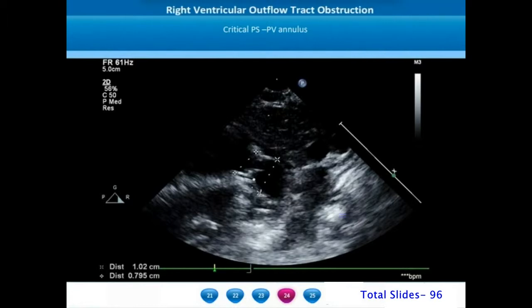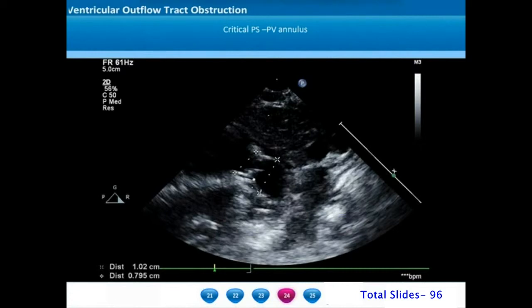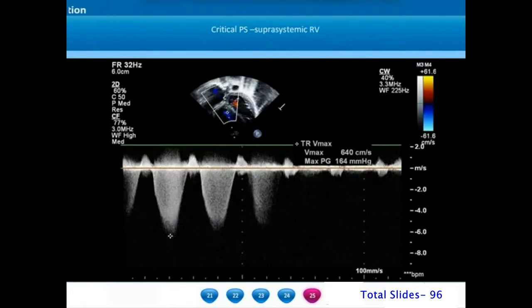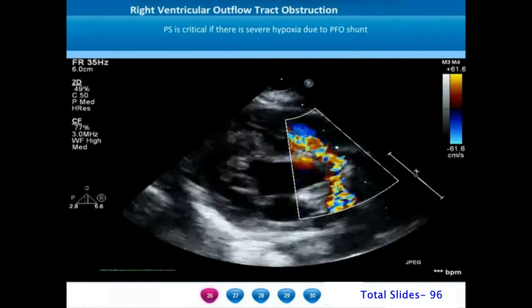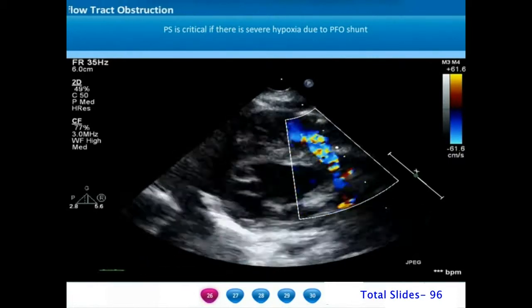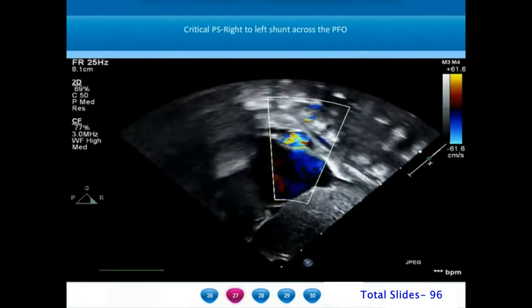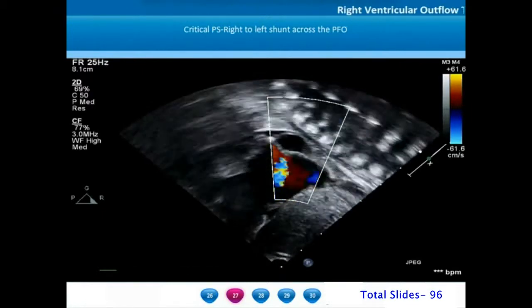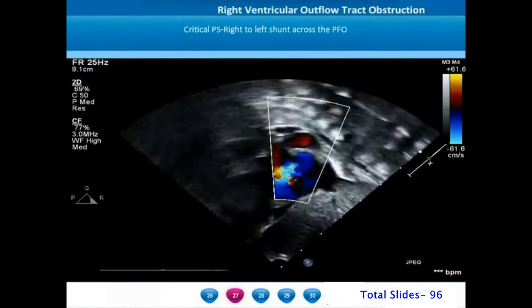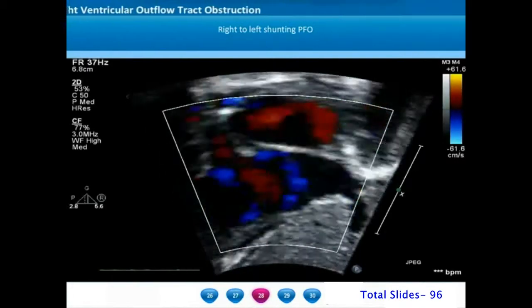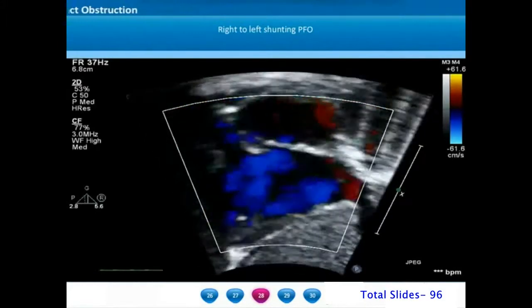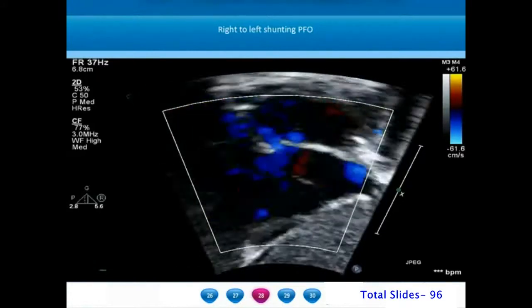Whenever the pulmonary stenosis gradient exceeds 100 to 120 mm of mercury, the right ventricle is likely to be suprasystemic. Critical pulmonary stenosis with right-to-left shunt through the patent foramen ovale can be confirmed from the subcostal view by interrogating the interatrial septum. We can magnify the atrial septum in the subcostal view to clearly appreciate the right-to-left flows through the foramen ovale.